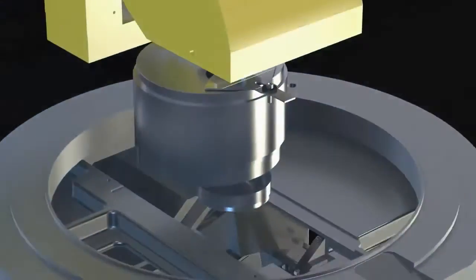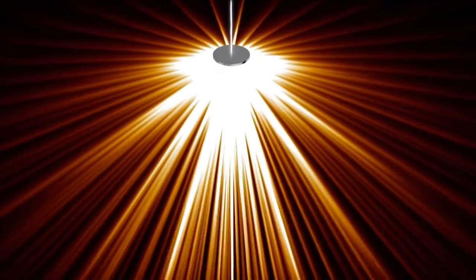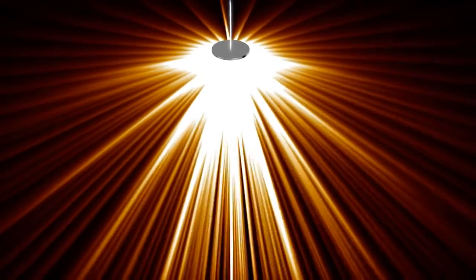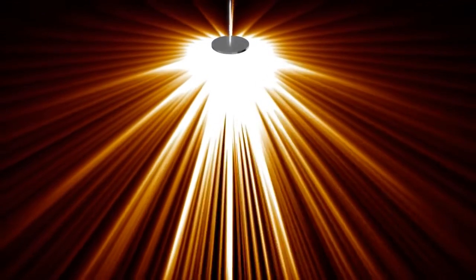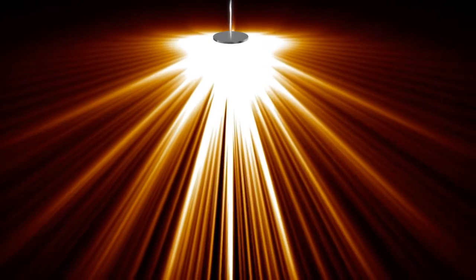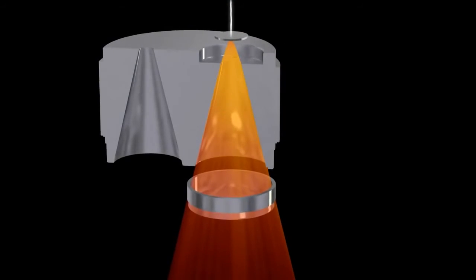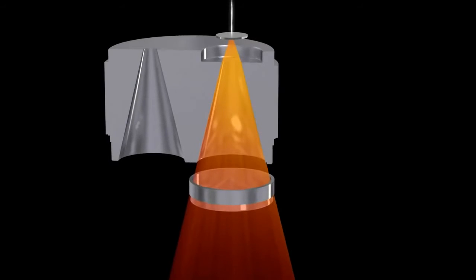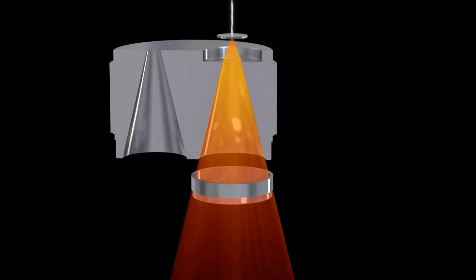The high-energy electrons hit a small tungsten target where the electron energy is converted into photons, or X-rays. The high-energy photons emerge from the target in a variety of directions. The primary collimator only allows forward-traveling X-rays to pass through, creating a cone-shaped beam.